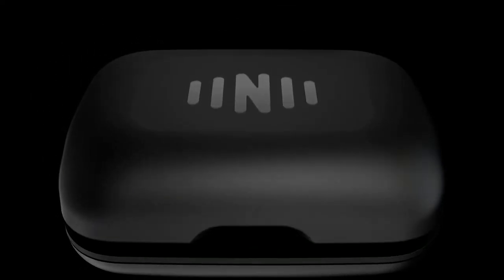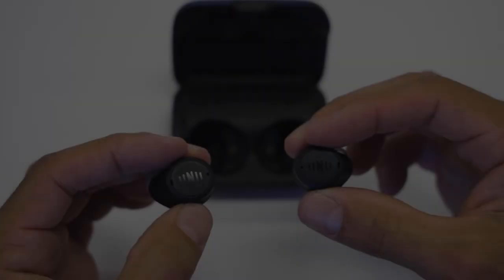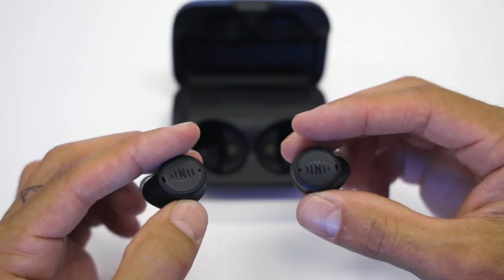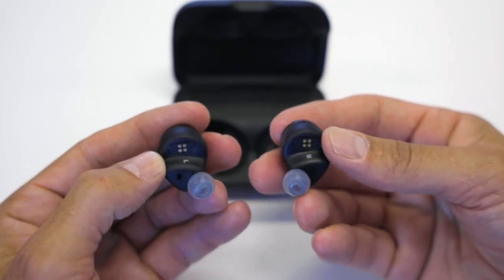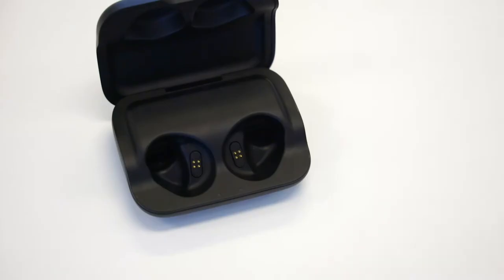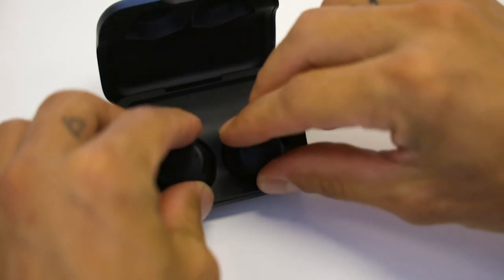Charging your IQ buds and their charging case is simple. Charging happens through the gold contacts on the bottom of the buds and the gold pins in the charge case. IQ buds charge through the charging case.